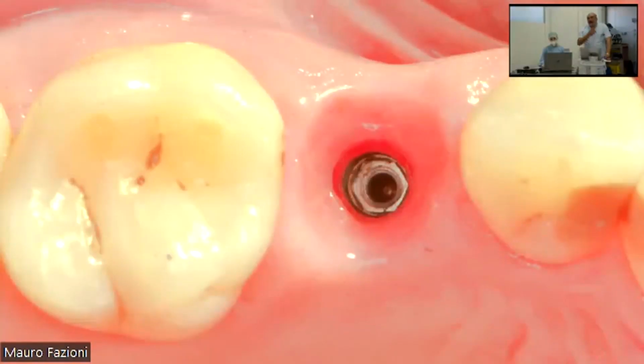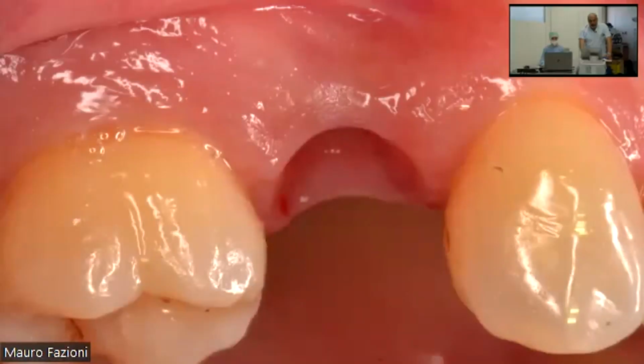This is what happened one month later. As you can see, in 4 weeks we have this kind of soft tissue healing. It is performing very well for the gum and the dimension, the vestibular and palatal dimension.